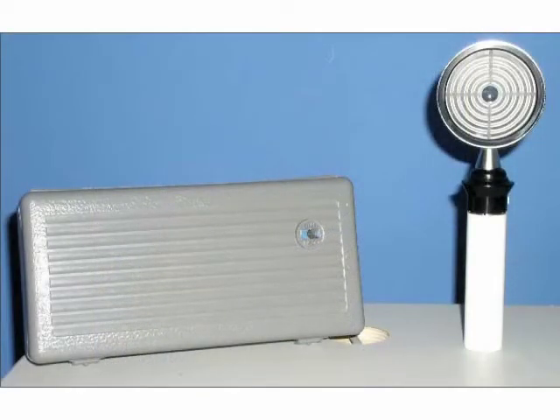This is a Klein keratometer. It's the same thing as a Placido disc with the addition of two things. Number one, it has a light source so that the rings actually light up. And number two, it has right in the center, rather than a hole through which the ophthalmologist will look, a plus lens which serves as an aid for the ophthalmologist, for the very ancient ophthalmologists who have become presbyopic. I speak, of course, not of myself, and need to get very close to the patient's cornea and still be able to resolve the rings.